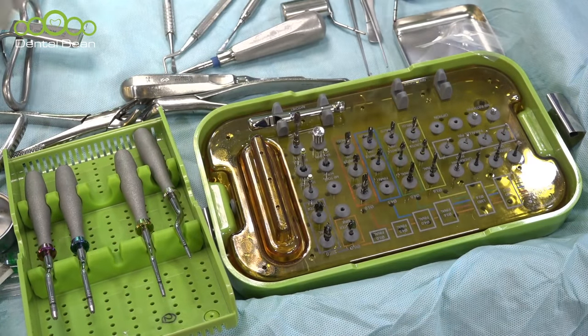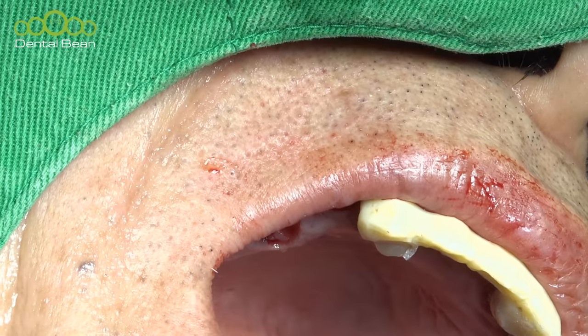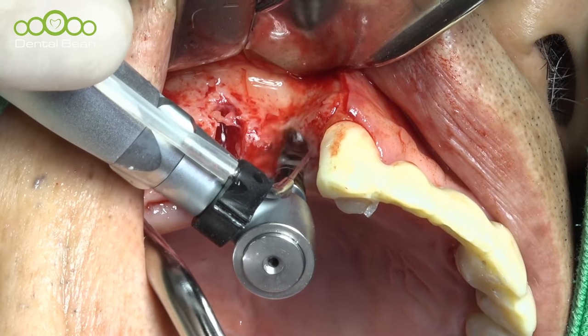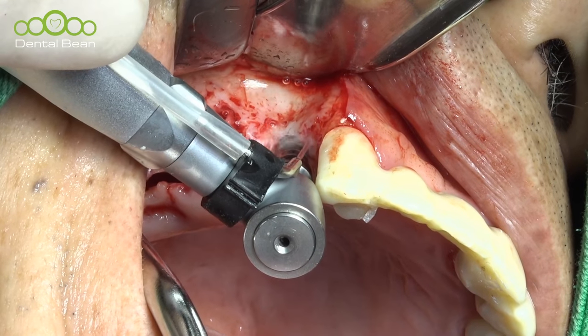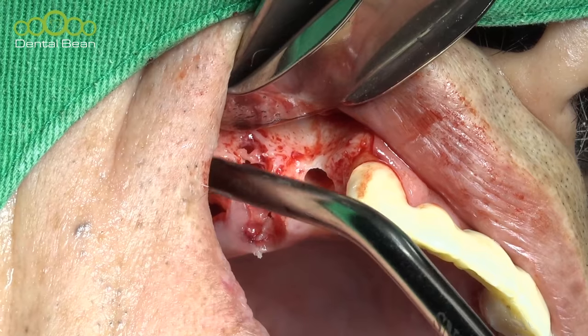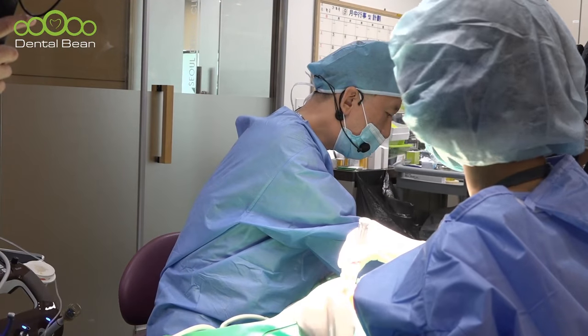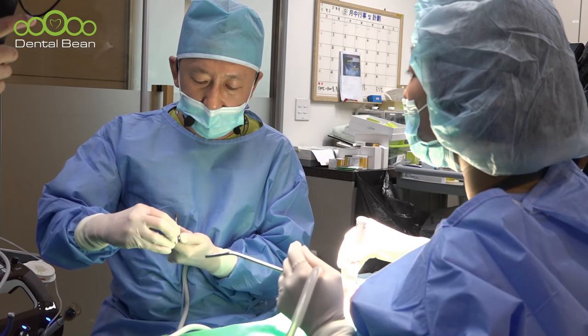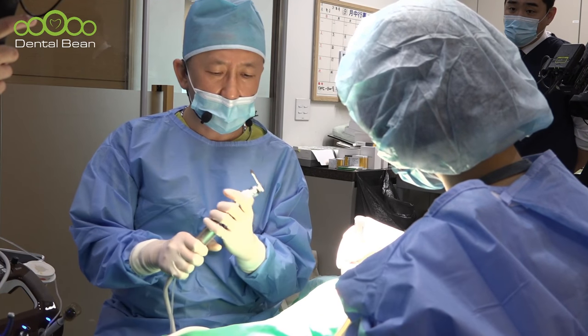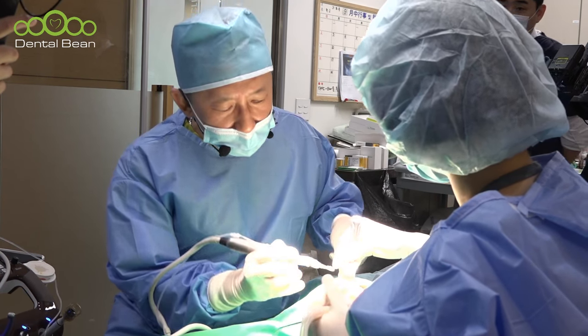Okay, next one, 4.5 drilling. Maybe no thread exposure. So at this time, just osteon collagen is very good for the bone.